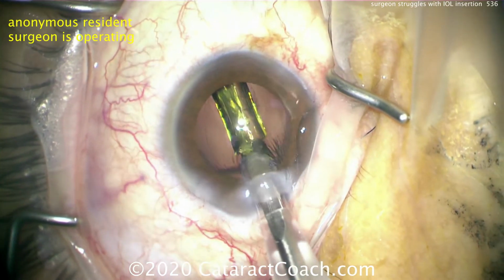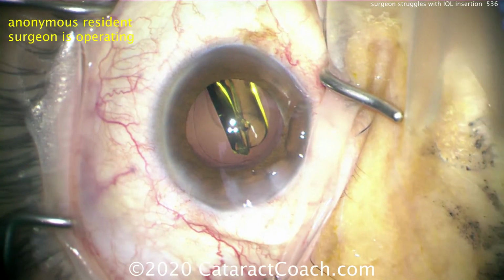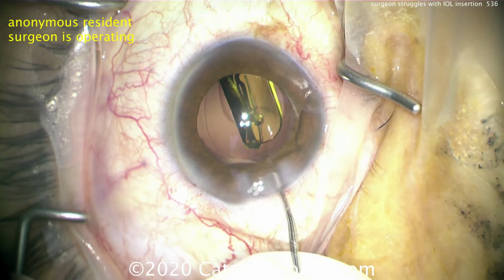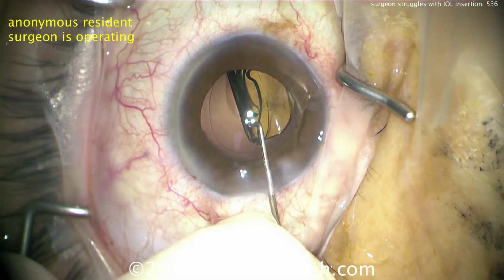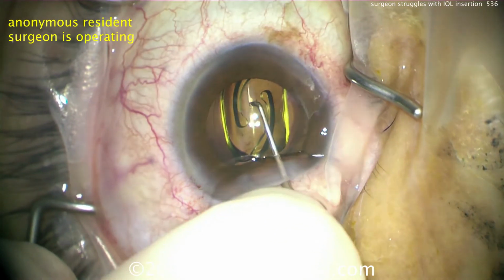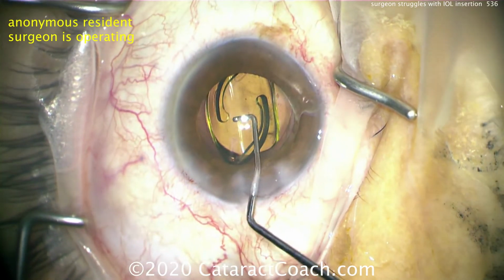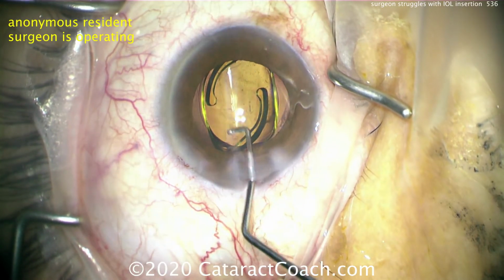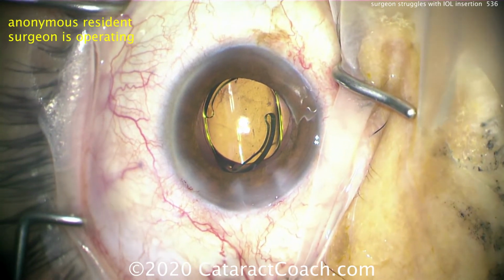Here comes the IOL going inside. It'll open up slowly. It's in the correct orientation. Don't worry, it's not in upside down. Here's the mistake. As the resident manipulates this, the incision is distorted and all the viscoelastic is leaking out of the incision. So now all of a sudden, the bag collapses and the AC becomes really shallow.